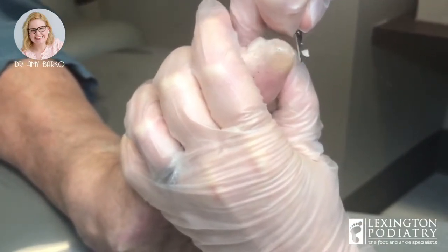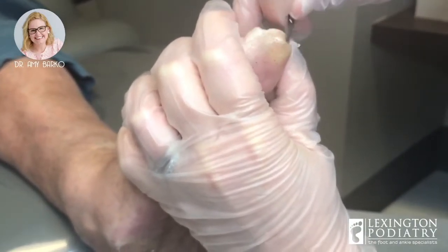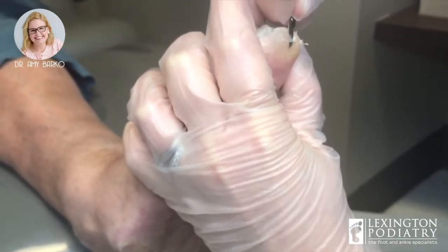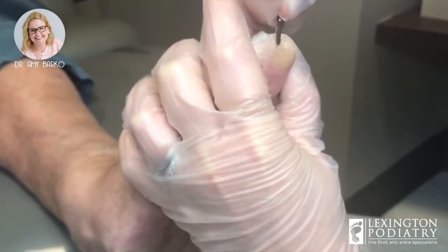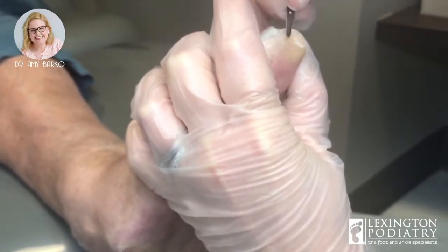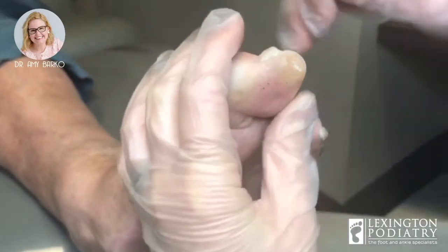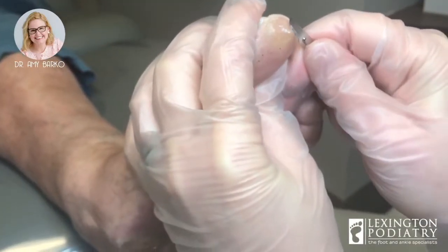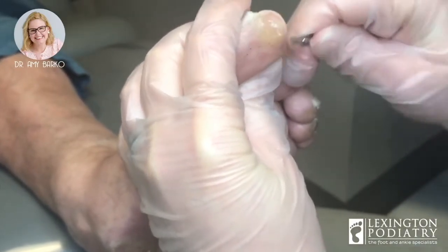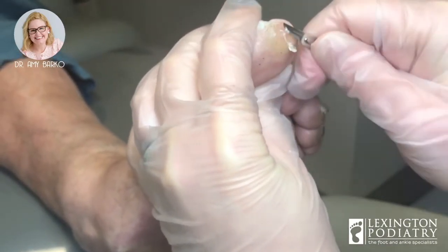So when you're trimming calluses, you try to pay attention to the patient's pain. Some patients are very sensitive. I'm very lucky right now. She is not. She lets me do what I need to do. But always pay attention, and if your doctor's trimming a callus and it's hurting, just let them know, because they can slow down. They can take a smaller bite, which helps.